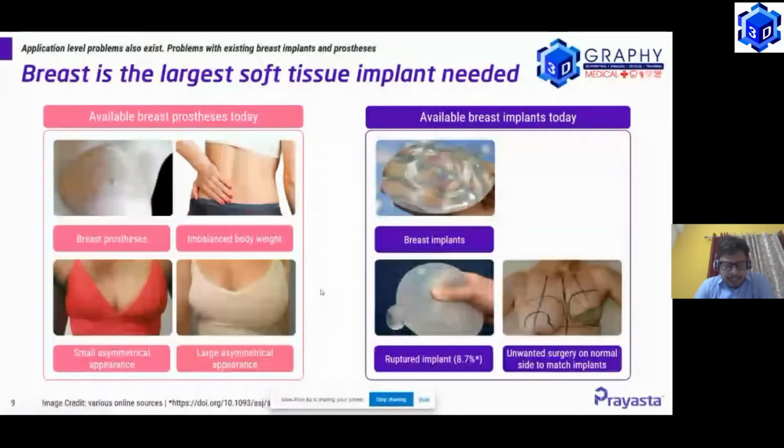And on the implant, some specific issues. If you have seen a breast implant, it's literally the structure of a balloon: a thick silicone balloon filled with silicone gel inside. The very obvious first risk that comes to mind is leakage. Breast implants do leak inside the body. In fact, 9% of all breast implants, in spite of all the great quality control, do leak inside the body.